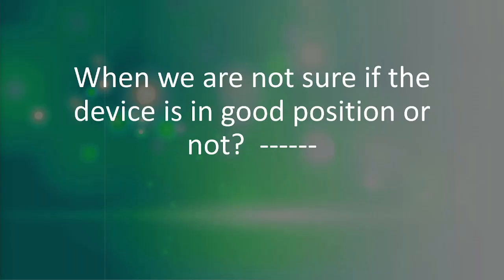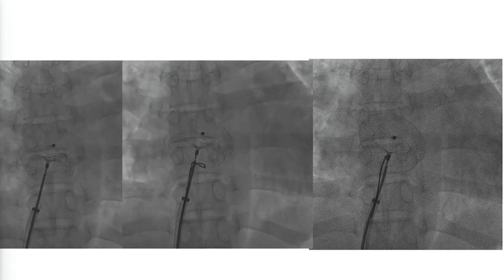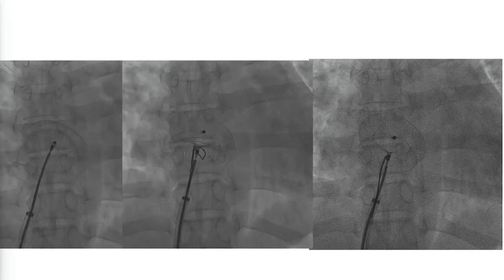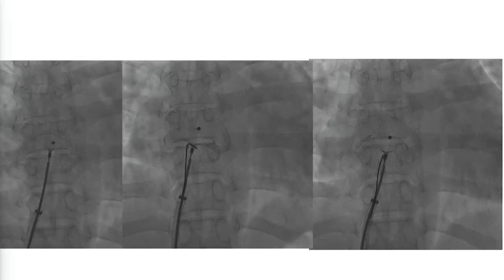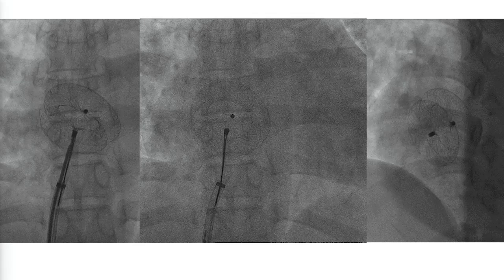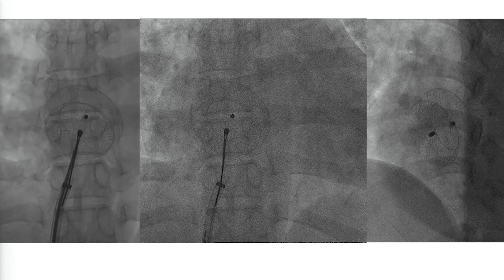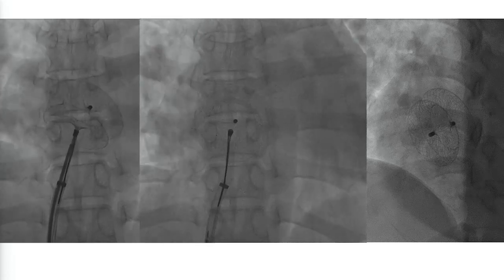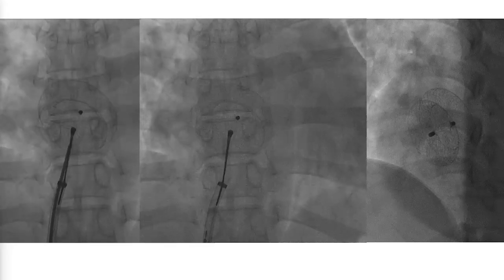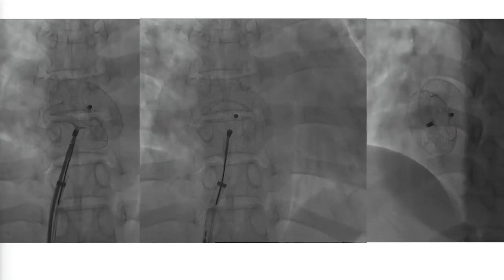When we are not sure that we are in good position, what to do next? In this case, we are not sure that we are catching all the rims. Then we took the snare, we cast the device with the snare, and here we release the device, catching the device with the snare. The device is good in position, so we release it. We can use this snare technique in difficult cases.